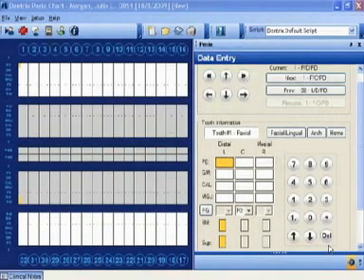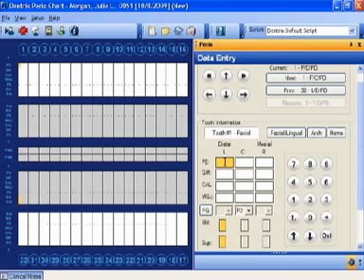This is the Dentrix G4 perio chart. You can choose to update the last perio chart or start a new one. First, we'll just start a new one, and then I'll show you how to do the update. The Dental R.A.T is going to just follow your set path with Dentrix, and I recommend just leaving it on the default script. And then it's going to just automatically advance from tooth to tooth, and you can just mark your bleeding and recession as you have it.